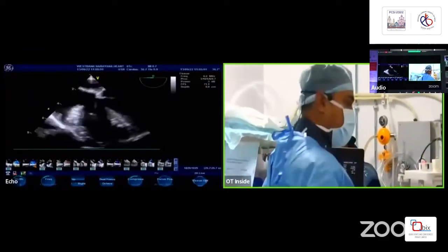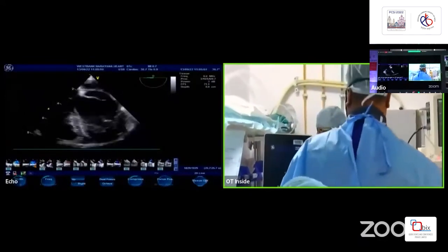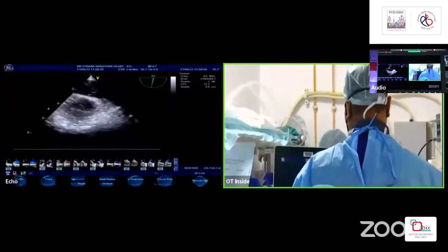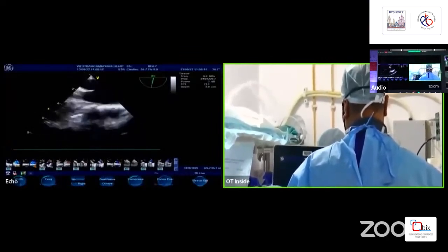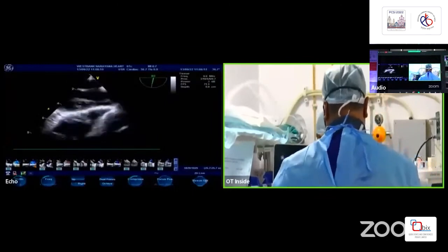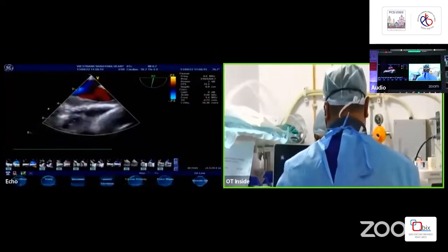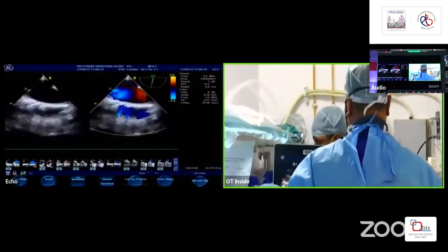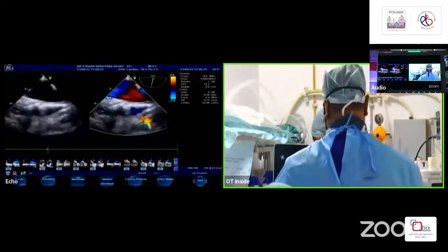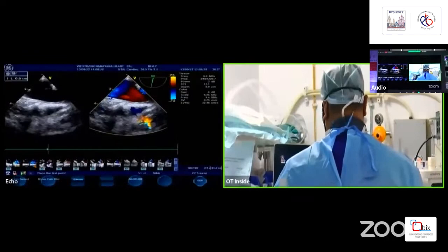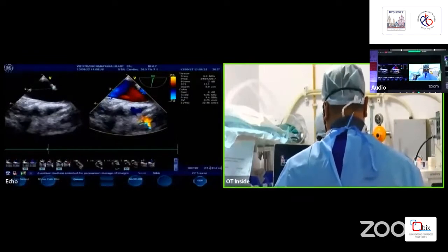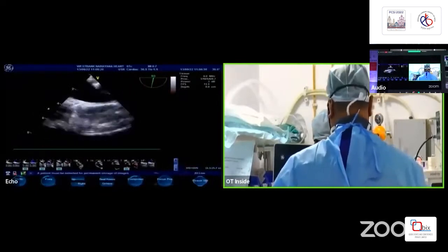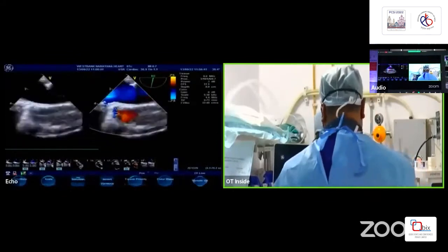On transesophageal echo, let's go to the mid-esophageal bicaval view at around 70 to 80 degrees where we can see the sinus venosus ASD. As you can see with color Doppler, we are getting a left-to-right continuous flow. Taking the measurement, we are measuring the defect at approximately 19 mm in this view. With color, you can also see the SVC flow.